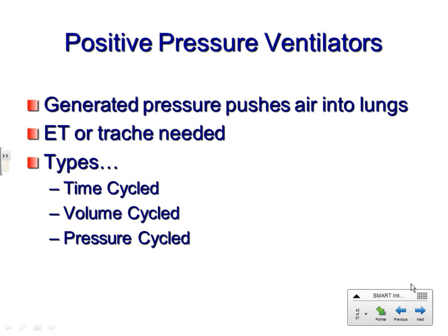Why do you think that would be a problem? It's not like normal breathing, and what can happen? Overinflation, hyperinflation, even damage. You can even blow out the lung. Volume cycled ventilators, and these are the most common types, similar to what she was showing you here.